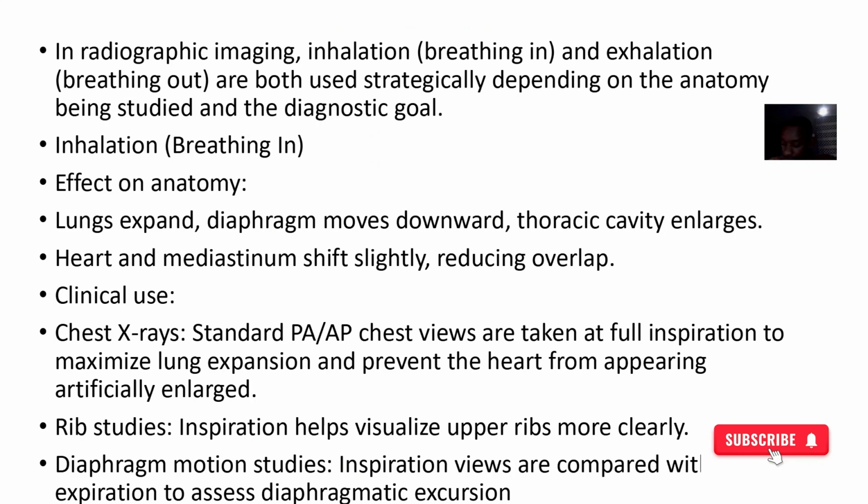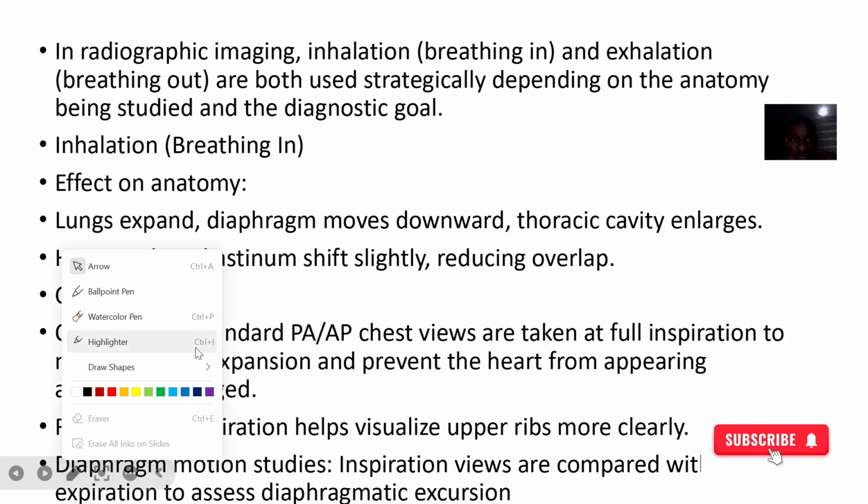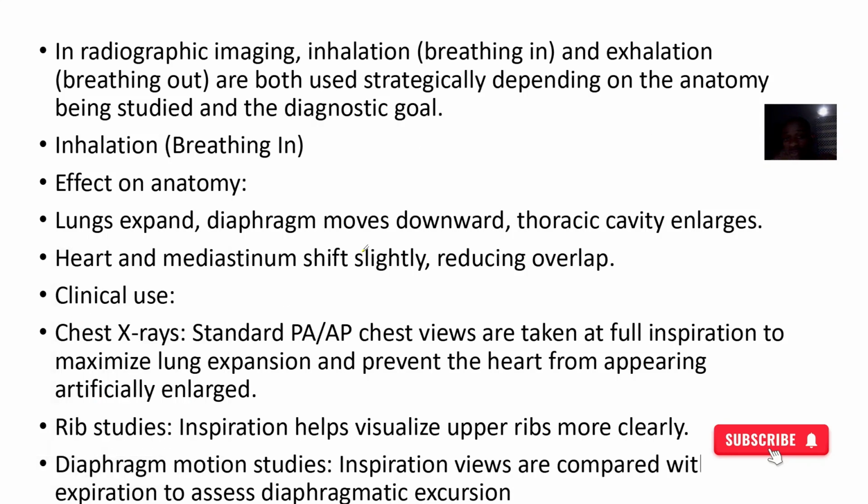So we said that in radiographic imaging, sometimes they might ask you to breathe in and breathe out. Both of them are used strategically. It's not like they just decide. They use it for a particular reason. So the effect on anatomy for breathing in, that's inhalation.